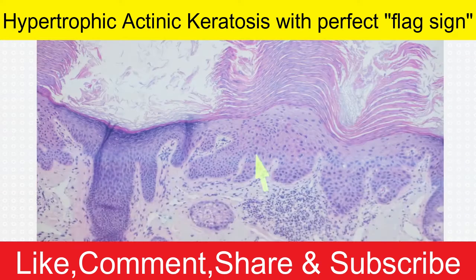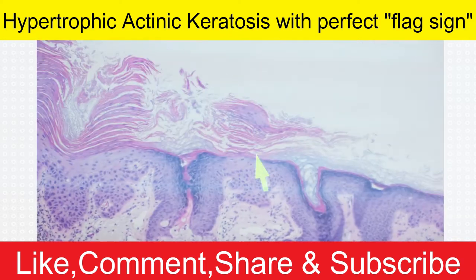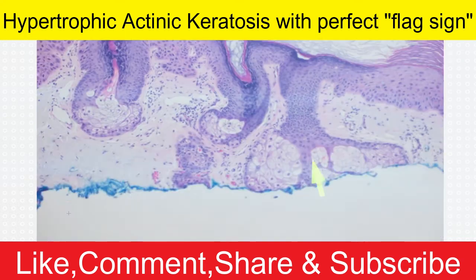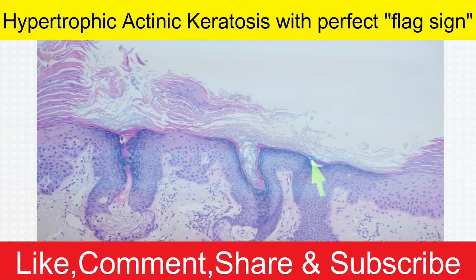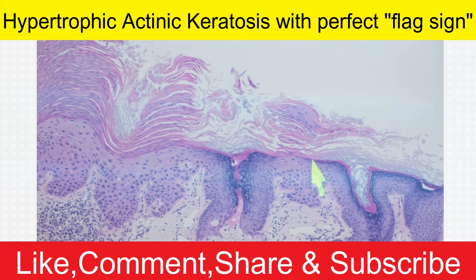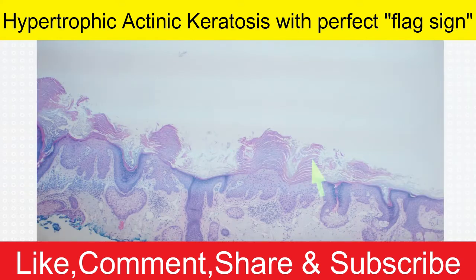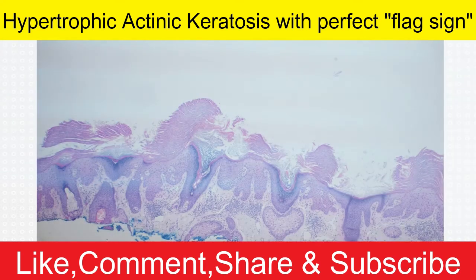But back to the thing that I got sidetracked from earlier: here you've got the AK, and then you can see that it skips past this follicle opening, and then there's more AK, and then it skips past this follicle opening, and then there's more. That skipping or sparing of the adnexal openings, the hair follicle and sweat duct openings, is really characteristic of actinic keratosis, and it produces this alternating pattern of columns of parakeratosis with areas of loose orthokeratosis in between. Some people have likened that to the appearance of a flag, and so they call that the flag sign.